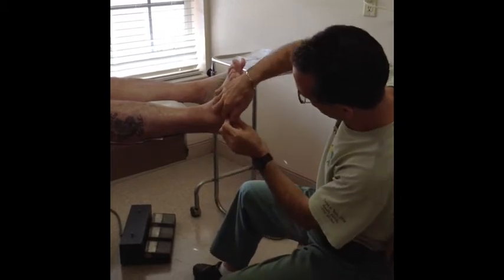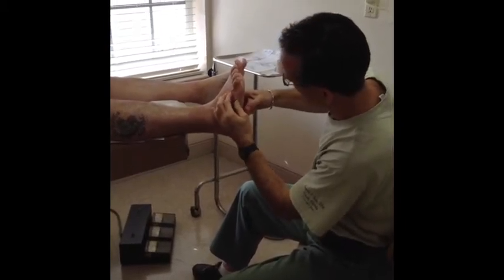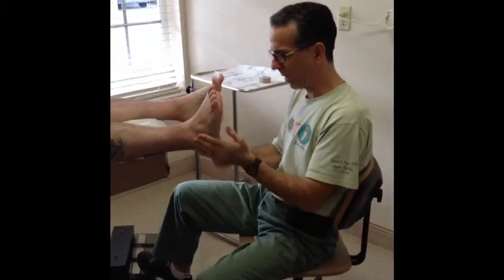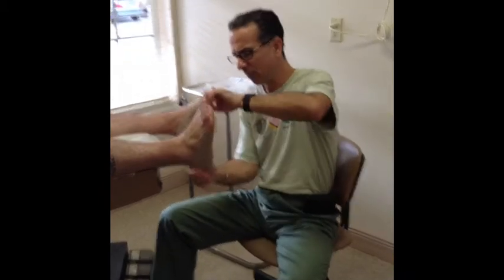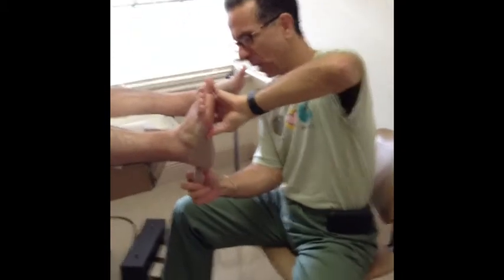What we're doing here is the low dye taping. We do a lot of different taping, but this is one of our simple and standard ones. We basically overlap half and work our way up, but we don't want to go underneath the first metatarsal head because that would actually elongate the plantar fascia rather than shorten it.